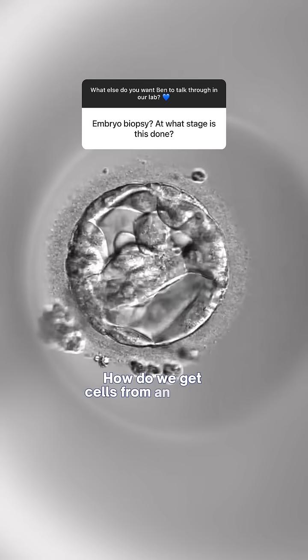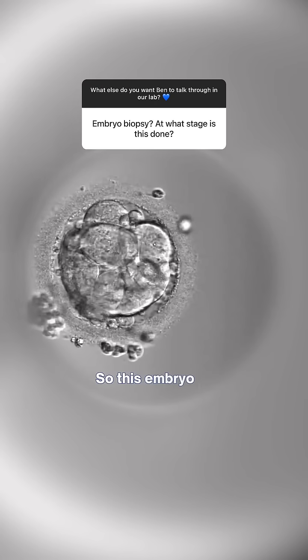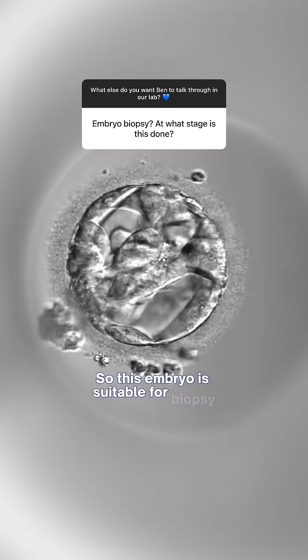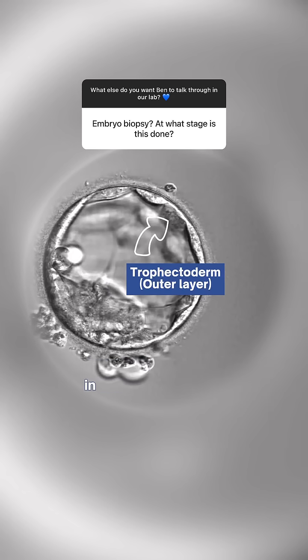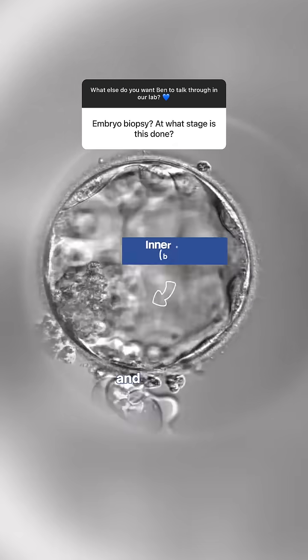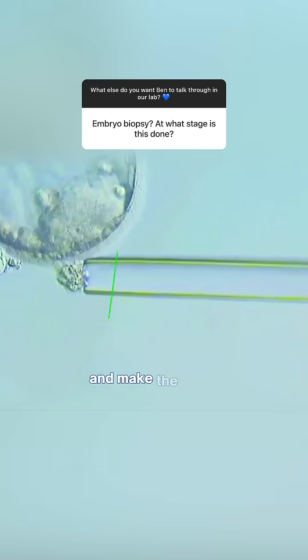How do we get cells from an embryo that we want to genetically test? This embryo is suitable for biopsy because it has a good number of cells in the trophectoderm — the all-important cells that we're going to biopsy — and a good inner cell mass, which is the part that's going to go on and make the fetus.